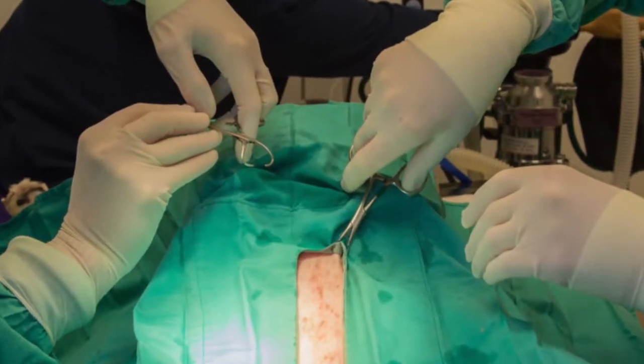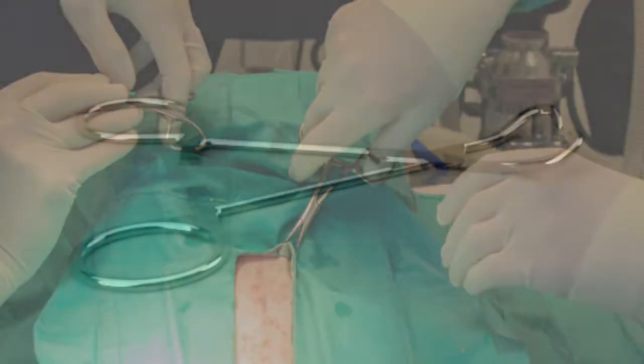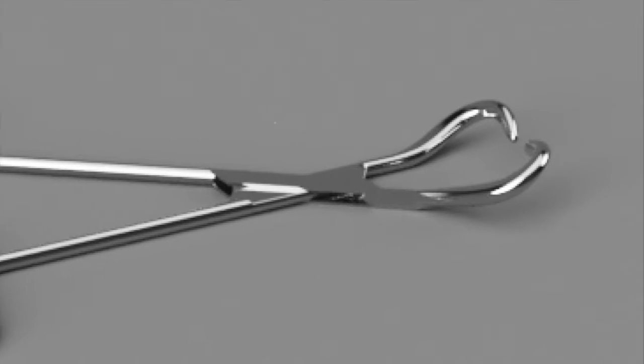The purpose of towel forceps is to secure drapes and towels to the patient so they do not move during surgery, and this is achieved in two ways. The first is by having a sharp, incurving tip. This clamp provides the instrument with a good grip.